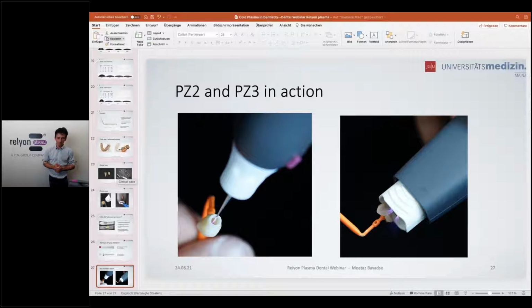As I could see, I did an experiment on this where I treated the zirconia surfaces, and 24 hours later I checked the contact angles and the wettability, and they had recovered. I would say a couple of hours, but how long exactly, I can't tell you right now.